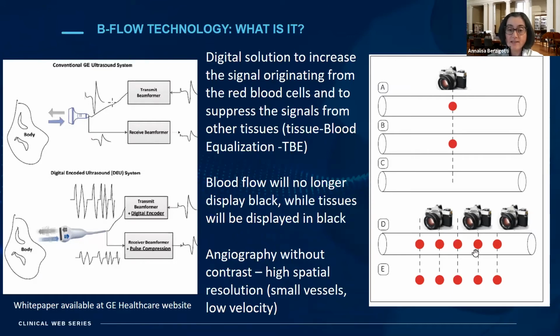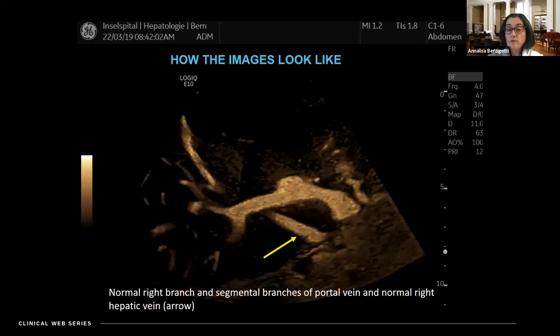So you are equalizing this, and this results in an image of the flow that will be white, or let's say coded in color, and the remaining tissue that will be black. So it will be a bit the opposite of what you are used to looking at in the standard B mode. So it's a way, let's say, to amplify the signal of blood without contrast, using just the standard B-mode signal you would get, amplifying it, and this will result in a sort of angiography without contrast with high spatial resolution. So how do the images look?